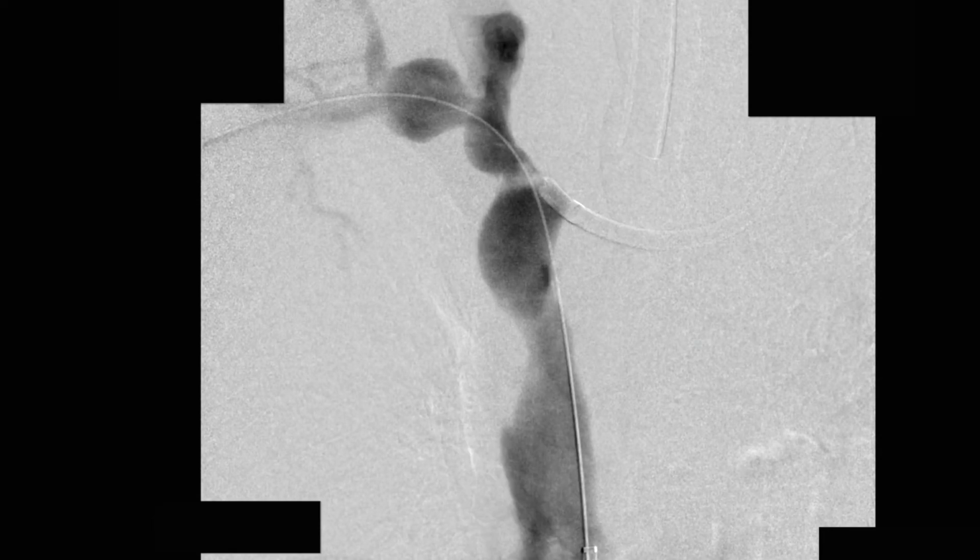A repeat venogram showed that there had been some improvement in the stenosis in the superior vena cava, as well as the right brachiocephalic and right subclavian veins, but there was persistent stenosis, so we opted to stent the superior vena cava portion.